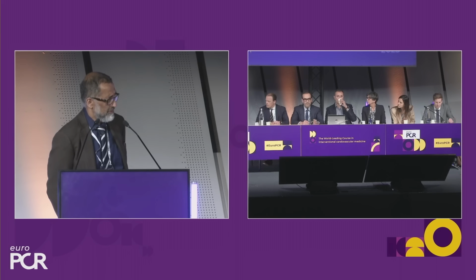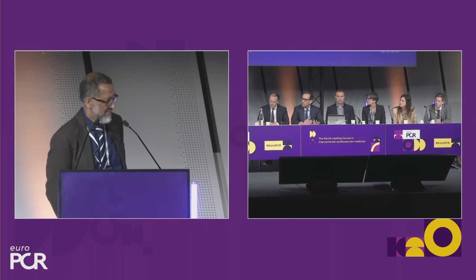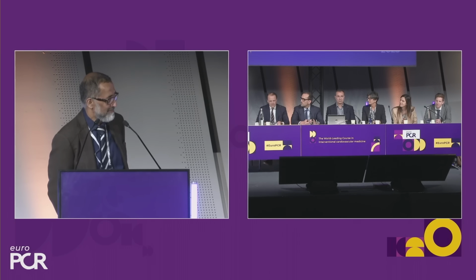We actually don't do it. So Chris Cook from the UK published a study which looked at how often that stops you doing the TAVI, and it's very, very rare when the CT's cleared the proximal LAD, the left main stem, the proximal right, which is clear in this case. If we see possible left main stem disease, we'll do an angiogram in advance. But otherwise, I'm not really targeting the coronaries. This is not a chest pain presentation. She's breathless. She's got severe symptomatic aortic stenosis. So as I've gone older, I've become more conservative in coronary intervention and more aggressive in TAVI intervention. So you'd have to twist my arm to put a stent into her, even if there was a narrowing in the mid-LAD. So we do not routinely perform an angiogram in advance.